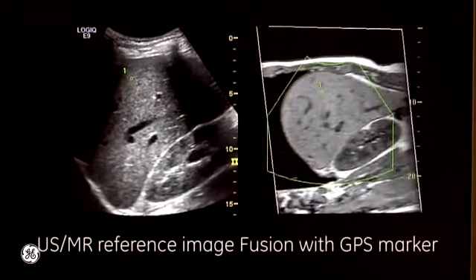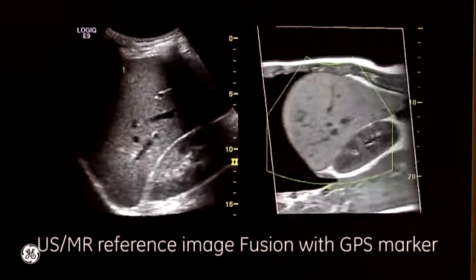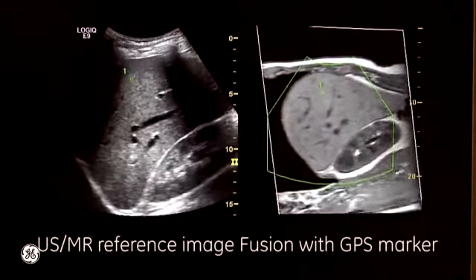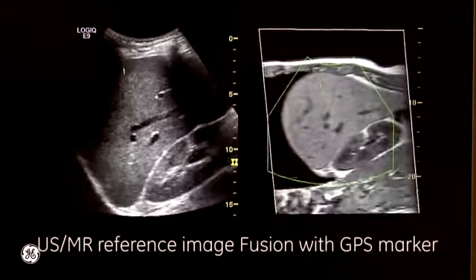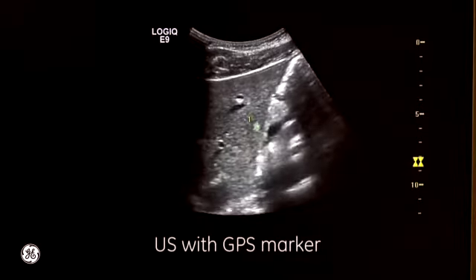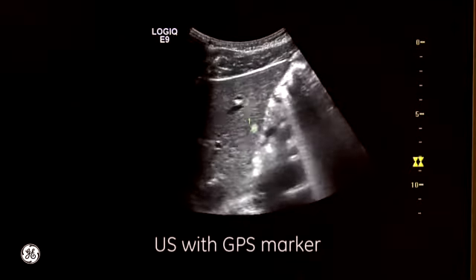If there's an area on either modality that needs to be interrogated further, you can drop a GPS marker as seen by the number 1. And as you can see, as we scan away from and towards the area of interest, the box gets larger and smaller to help guide me back. I can also use a GPS marker if I was just using ultrasound. As seen here, we're tracking a small hemangioma in this liver, and the GPS marker changes size as I move closer and further away.